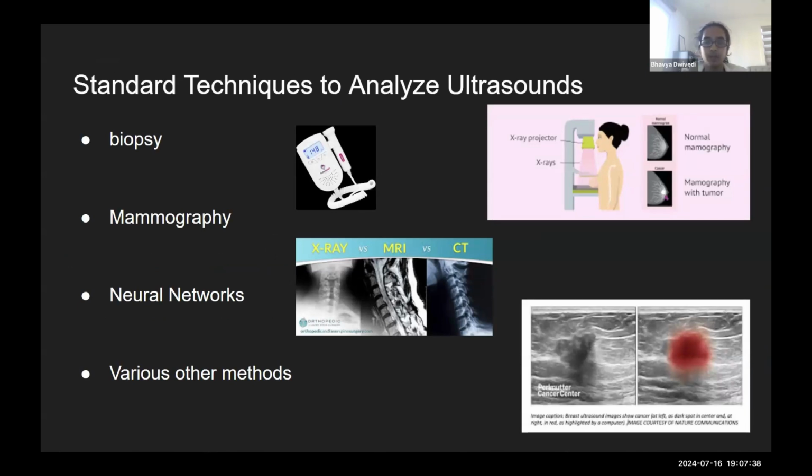a medical expert. Another method used to determine whether cancer is present is mammography, a technique used to detect abnormalities in breast tissue. This is specific to breast cancer, as the errors identified by the exam could potentially lead to cancer long before patients encounter symptoms that justify cancer being present. This breast imaging exam is performed through a mammogram, which is an X-ray scan of the breast.